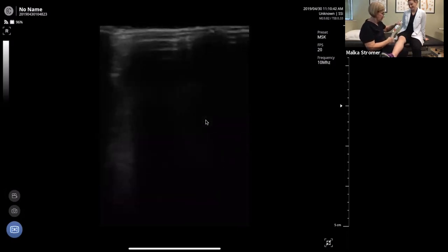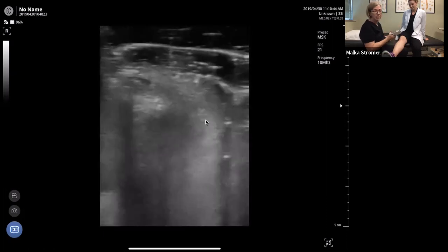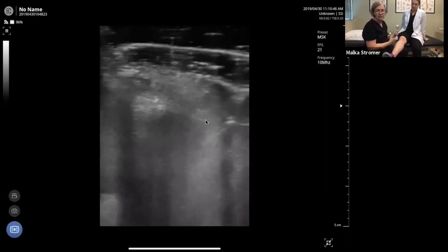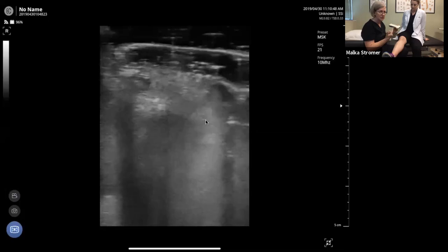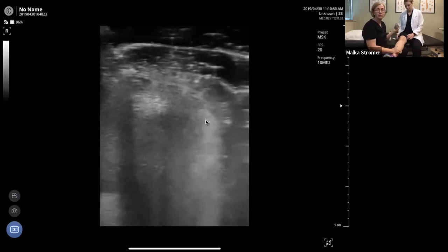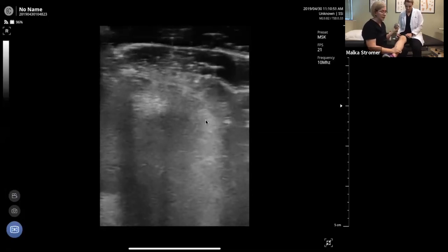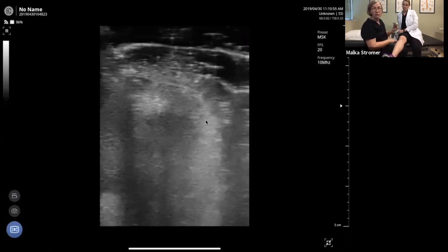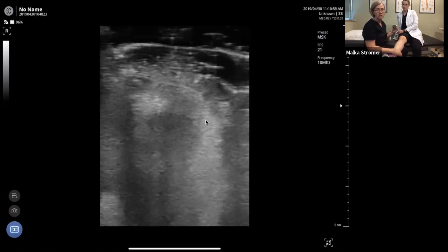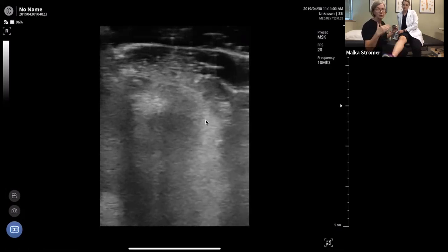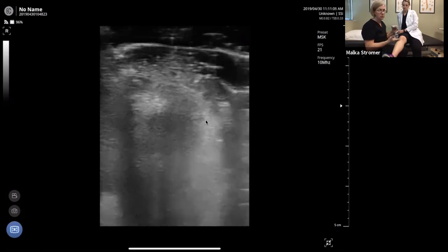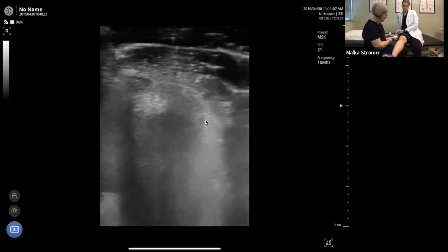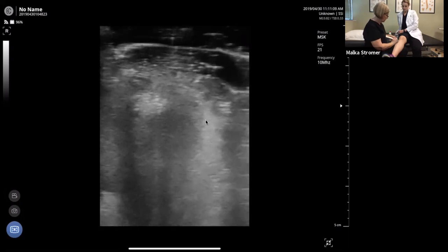I'm going to go lateral now. The best way to do any musculoskeletal scan is to have a set protocol and follow it every time. If the pain is on the lateral side, I still start medial — that way you make sure you get everything and don't leave out any part of it, especially when you're first beginning, because you can easily forget what you're looking at.